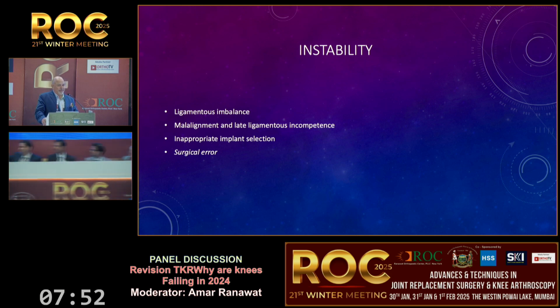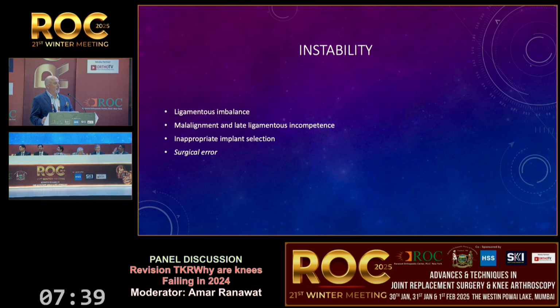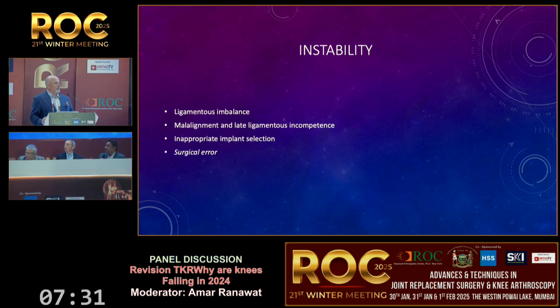Do you think the design of your trochlear groove matters if you're going to resurface or not resurface? Yeah, because the IB2 knees done when I came to India 25 years back are still doing good. So no problems. But definitely patellar friendly implants have made it much easier. There are no more releases now. The only thing is you have to see that the patella tracks nicely.